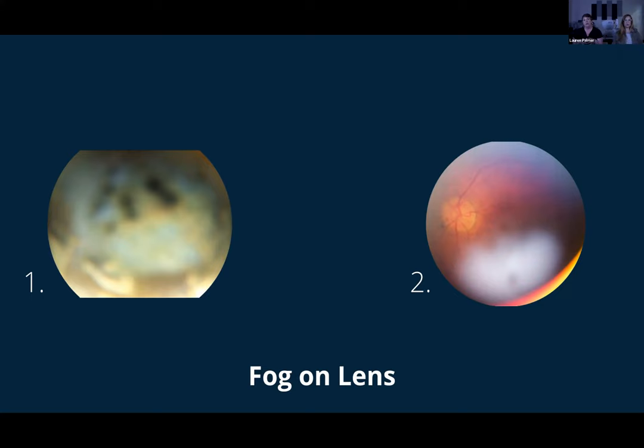If your patient is wearing a mask, then fog is a lot more likely to happen. Sometimes you'll see the fog on the lens before you capture the image. Sometimes you won't see it until after. So if you do happen to see it before the image is captured, you can just pull the handheld device away or pause the tabletop exam and allow the fog to dissipate from the lens. If you don't identify it until afterward, you're going to want to take a few steps to ensure that it doesn't continue to appear on the lens.